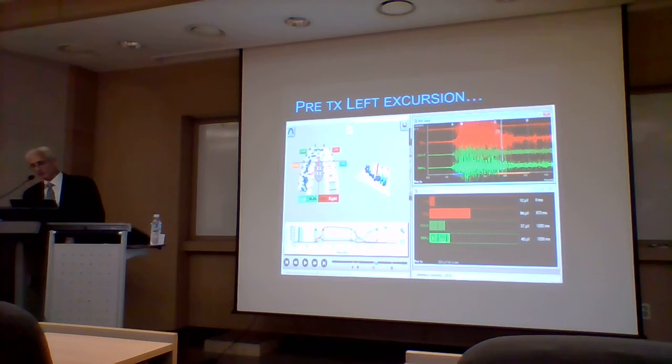And this is normal neuroanatomy. The non-working temporalis never fires. So if you move left, your right temporalis turns off instantaneously. If you move right, your left temporalis turns off instantaneously. And that actually is a good marker for where the excursion begins.